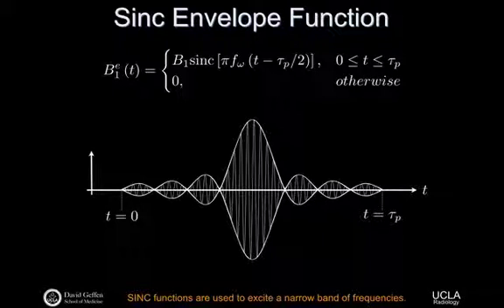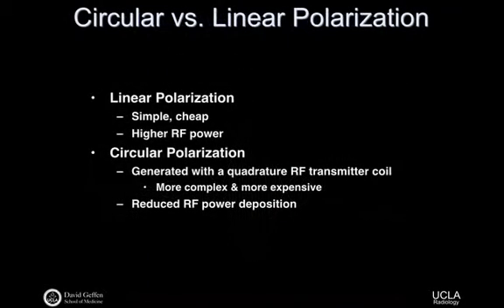This envelope function itself here basically controls the spectral information or the bandwidth of the frequencies within that pulse. And that has really special and important properties when it comes to MR imaging. We won't get into it in this lecture. This is just to say there are lots of other possible envelope functions that we could use there. Gaussian functions are possibilities. You're going to have a homework problem that probably uses a sinc function as the envelope. So there's different possibilities there. And we won't get into the details as to how you choose one or the other today, but just keep in mind that that's what we are kind of talking about.